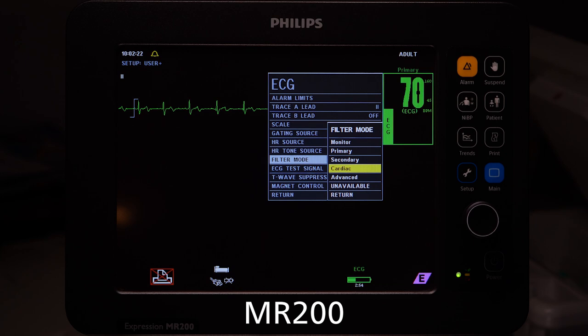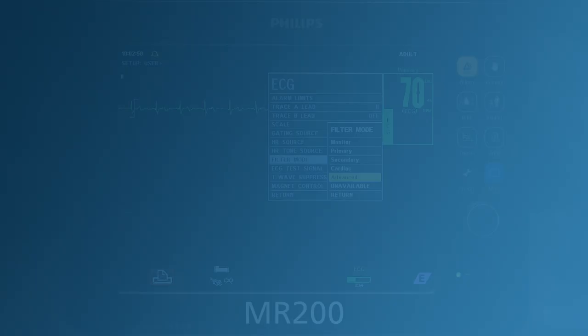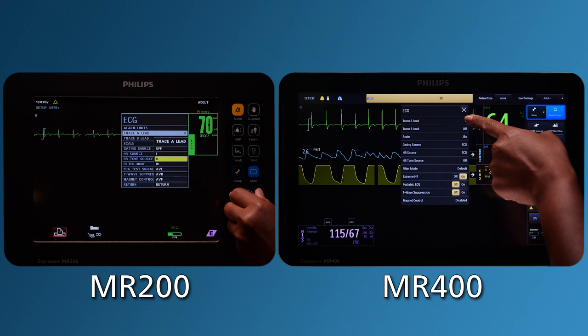Advanced filter provides the best possible performance on 1.5 and 3.0T MR systems during MRI sequences, such as neurological and cardiovascular. Advanced filter utilizes an adaptive filter scheme for removal of gradient artifact generated by MR systems. Cycle through the listed filters to determine which filter minimizes artifact. You can also attempt to change the lead view if you begin to get artifact while you are scanning.